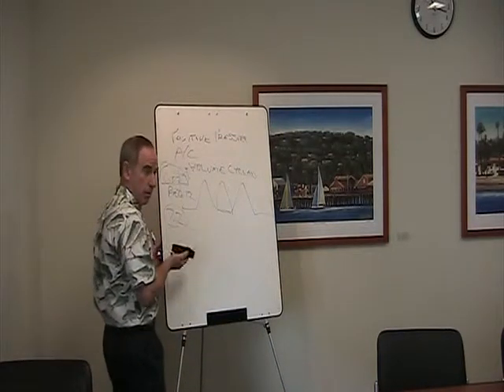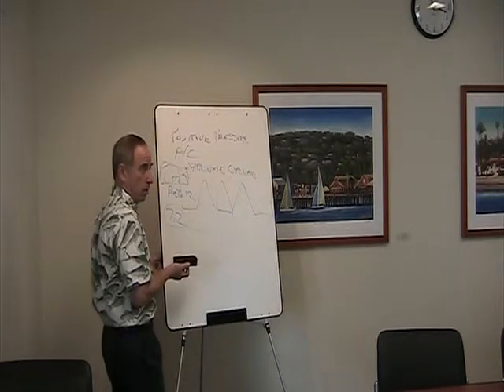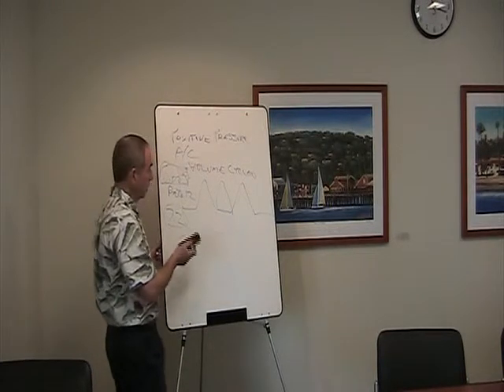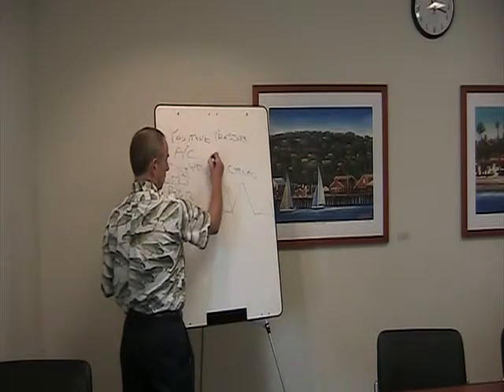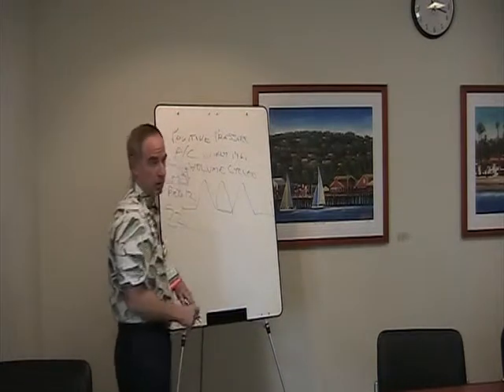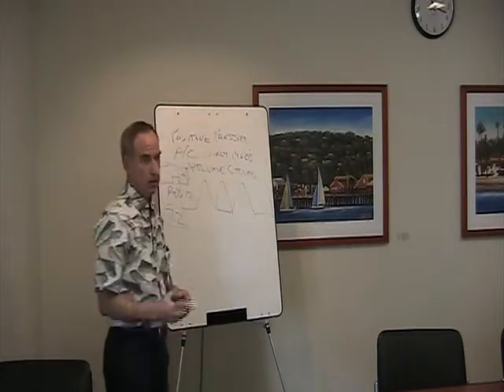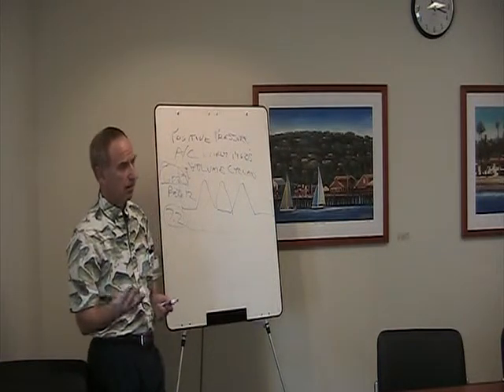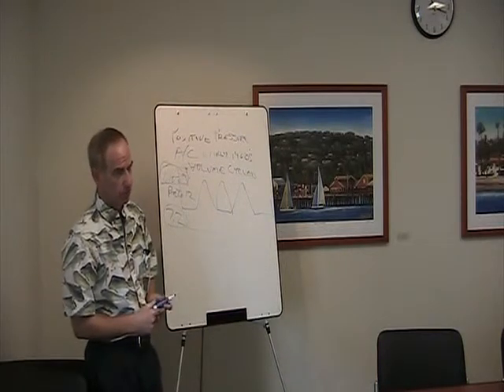Anybody have any questions about assist control? Assist control is still one of the most widely used modes of ventilation, even though this was developed in the early 60s, probably. So we moved from the 50s to the 60s now. Around the mid 60s, around 1965, the next mode of ventilation was developed.